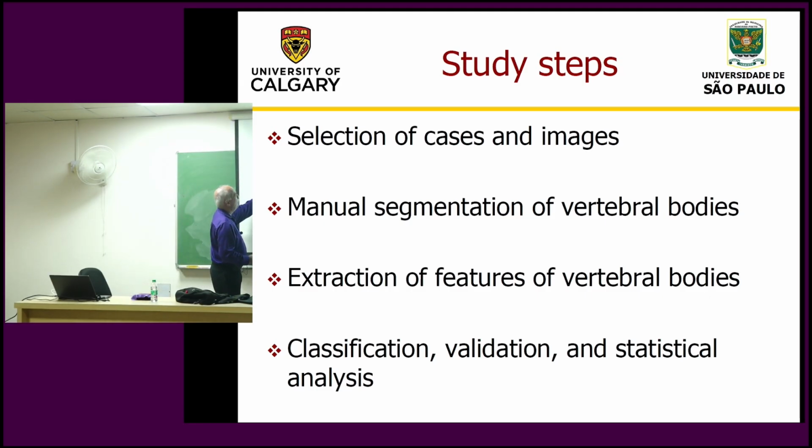Anyway, manual segmentation of vertebral bodies. When I said HIS and RIS, these things popped up in my mind. Extraction of features of vertebral bodies and classification, validation, and statistical analysis.